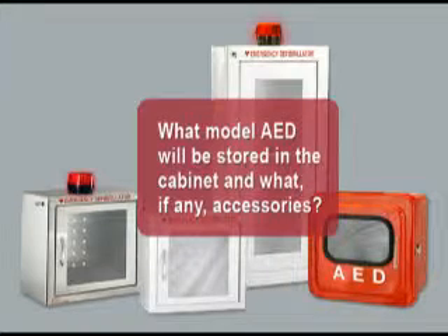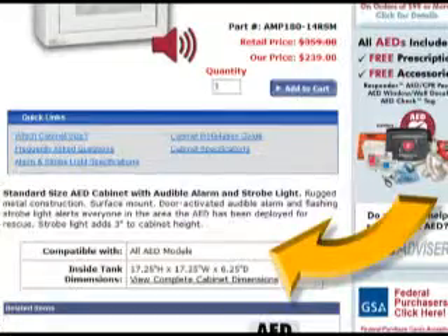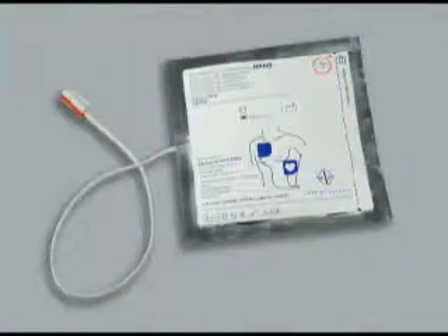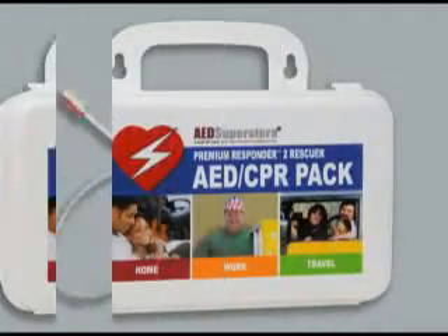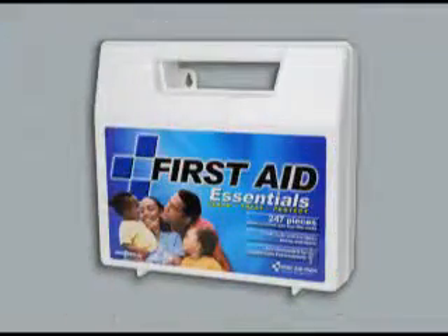What model AED will be stored in the cabinet, and what accessories, if any? Each cabinet featured at aedsuperstore.com includes a list of AED models it will house. Most cabinets will also accommodate small items like spare electrodes, a compact CPR AED rescue kit, or first aid kit.